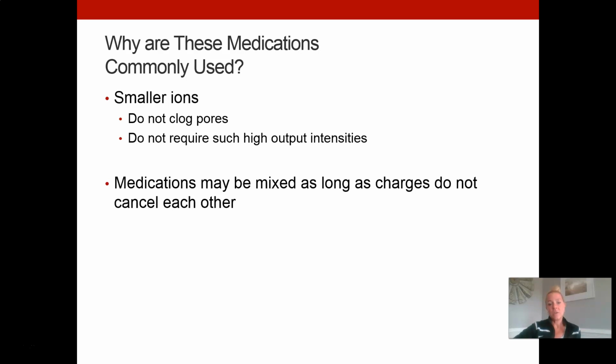Medications can be mixed as long as the charges don't cancel each other out, and I'm not talking about you being a mad scientist back in the PT gym. The pharmacist will do all this. So you just learn the list of commonly used medications and what charge they have, and then know how to set up your treatment accordingly.